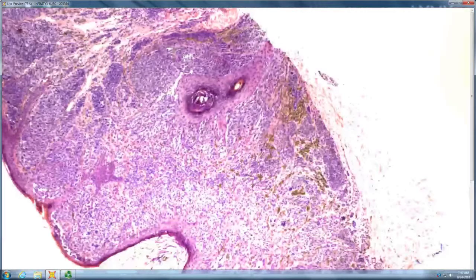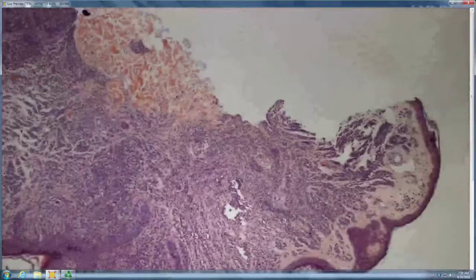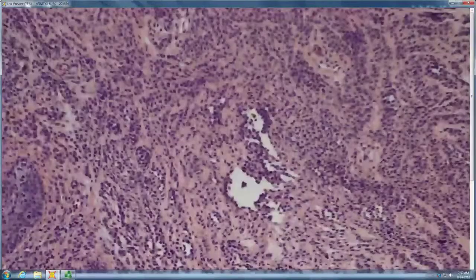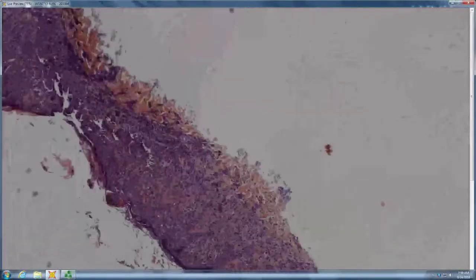Looks pretty nasty. Melanoma. How about on this side? Nevus. And then a melanoma on the other side. Nevus, and then melanoma arising in it. Depending on the study, somewhere between 20 and 40% of melanomas arise in pre-existing nevi.